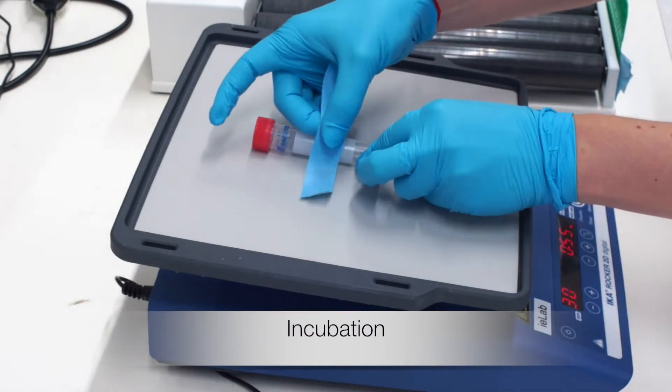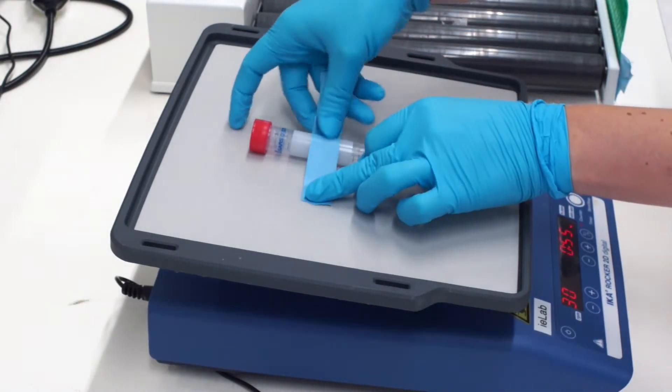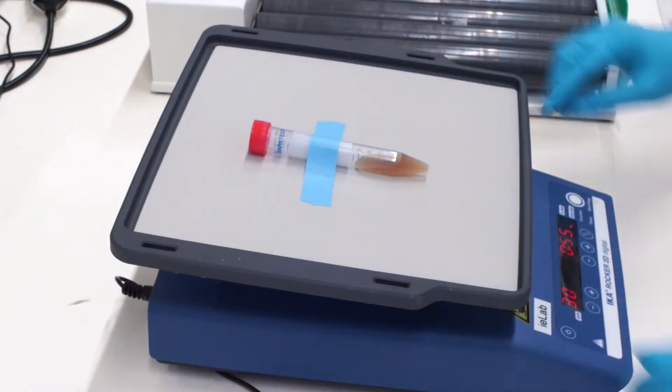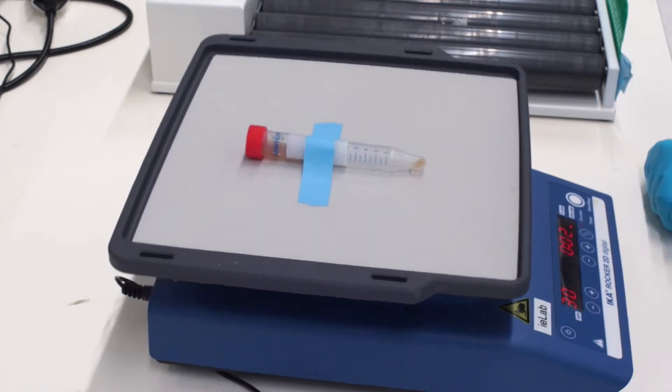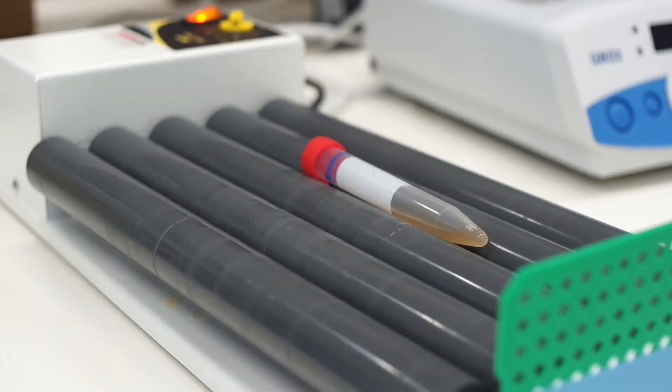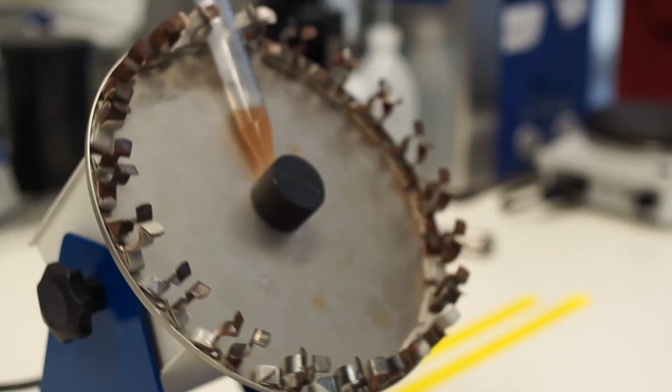Then I incubate the sample for 30 minutes at room temperature so the antibodies can bind to the target cells. The tube should be gently rocked during this incubation. Like this, or like this, or also like this.